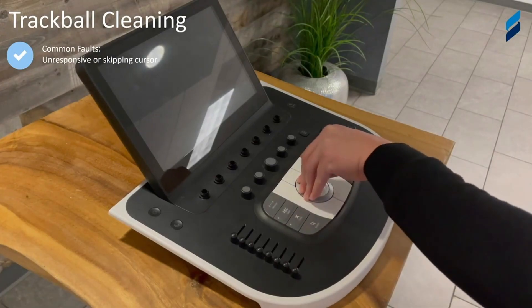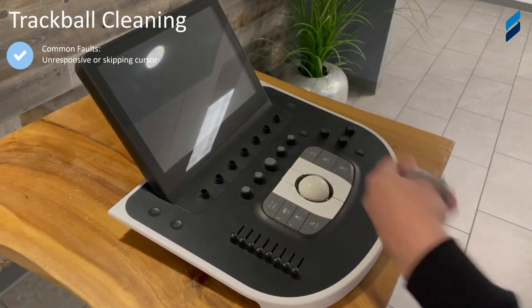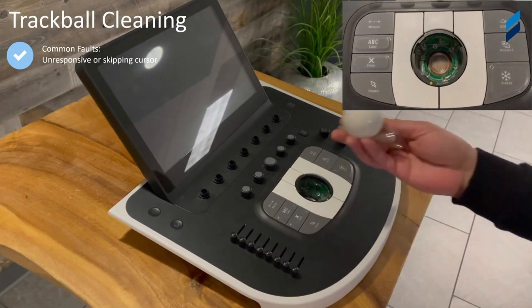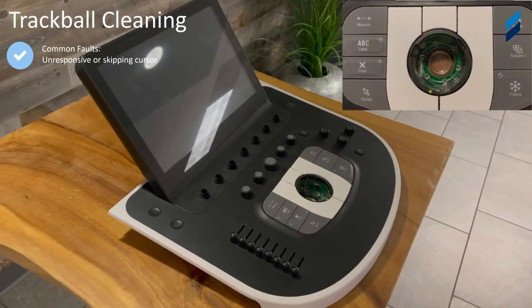Here's how we clean a trackball for PM purposes. Turn the silver bezel counterclockwise, like many other machines out there. We use a trick — some tape to get a grip on the ball so it comes out. And to the top right, you can see that cleaning those ball bearings in there will really help keep that trackball moving smoothly for the user.